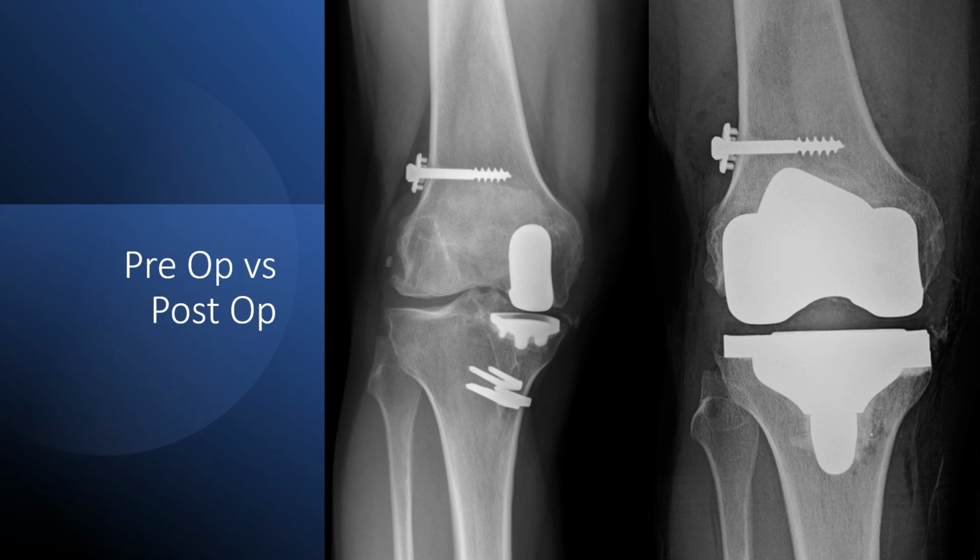However, these 2 staples are in the way, so we had to go after that. We were able to take out this femoral component, but there was very little bone loss, so we could just rest a natural tibial component on healthy bone. This tibial component was more difficult, so we took off 8 millimeters on this side, but then I had to drop an additional 5 millimeters to plan for this 5 millimeter augment right here. So you can see the natural tibia goes here, but I had to create another 5 millimeter augment so I could rest this on healthy bone all the way across. And now I have a symmetric extension gap and neutral alignment.